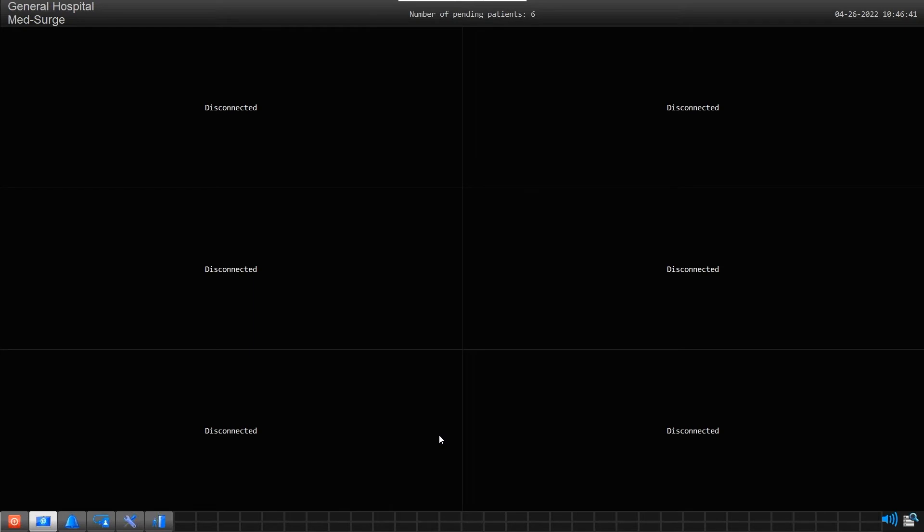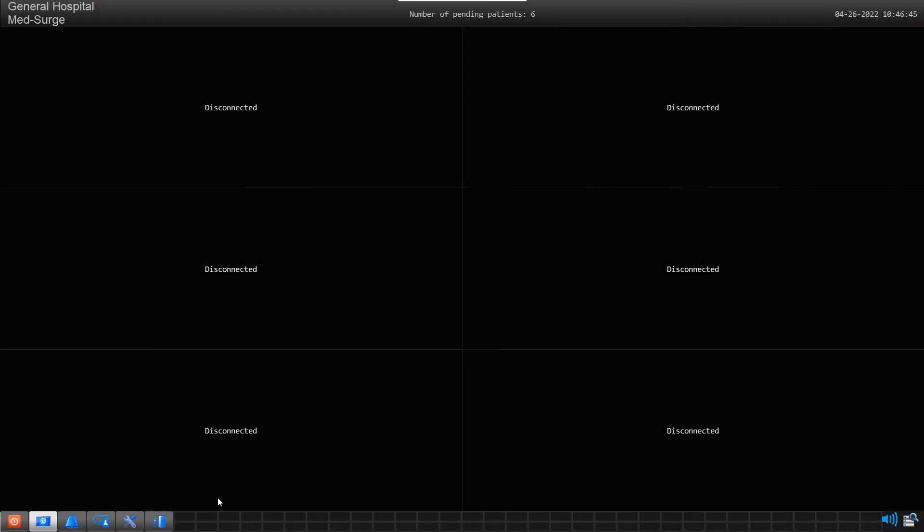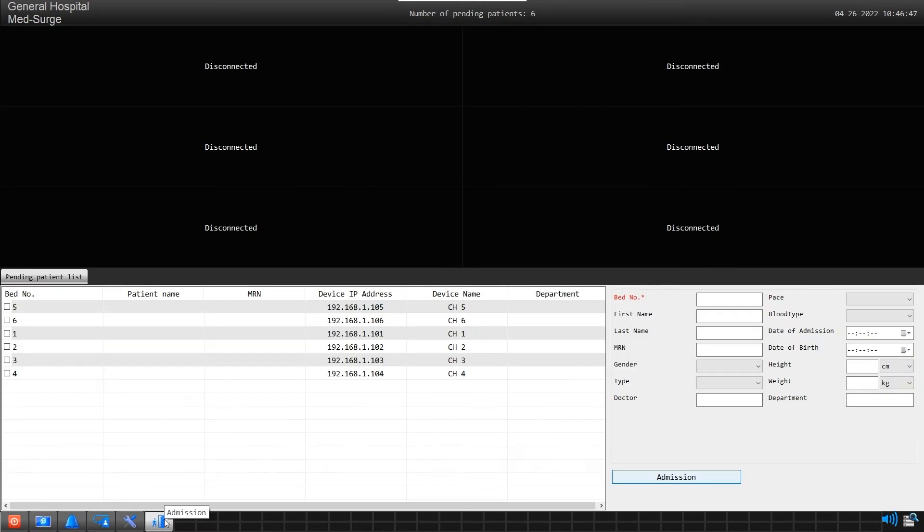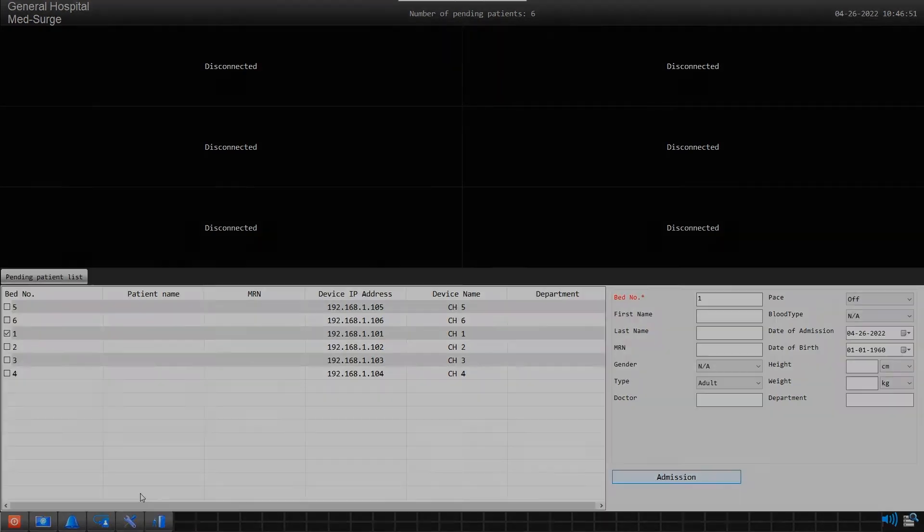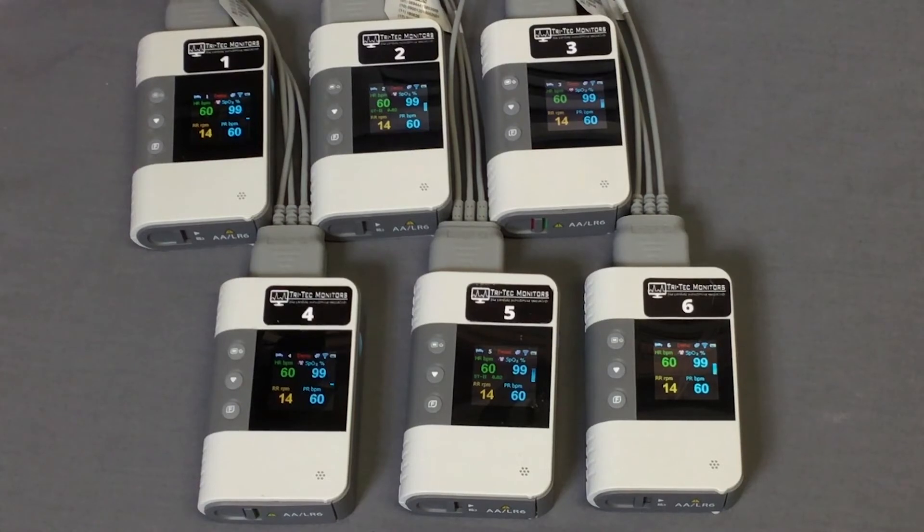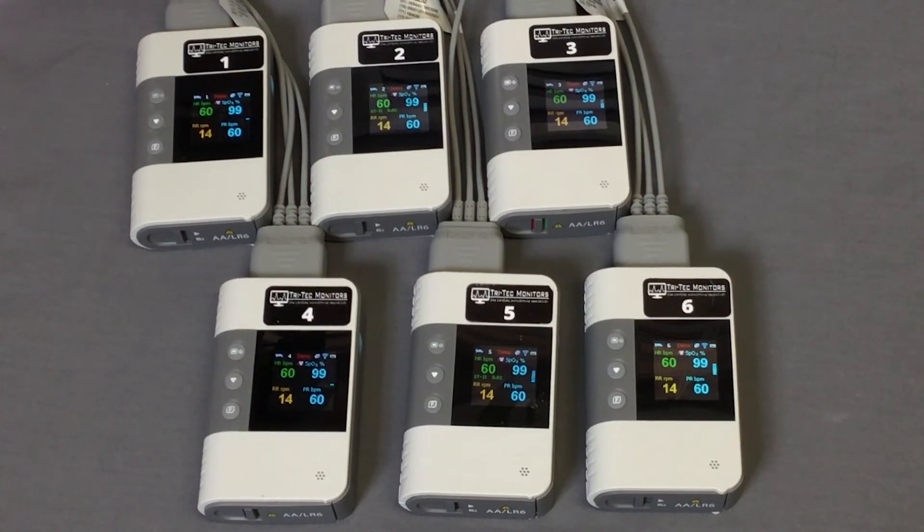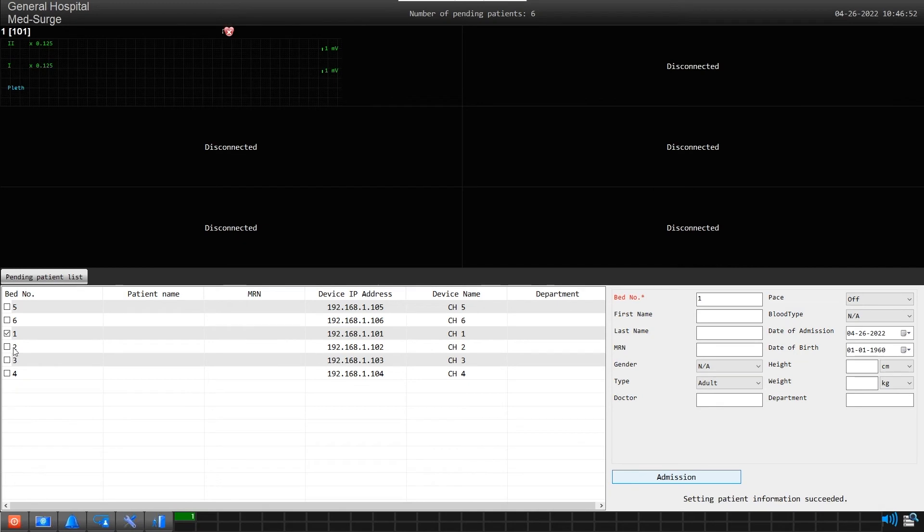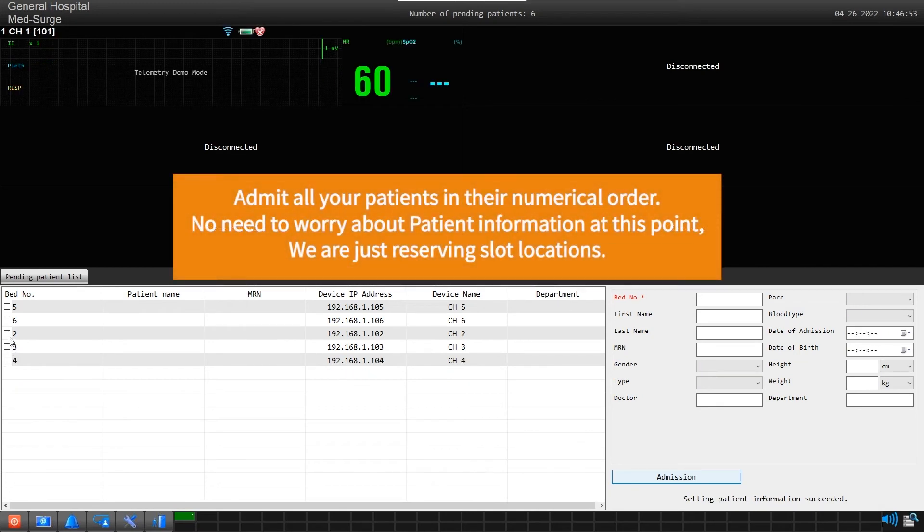Step 2: Next we must admit all your devices in their proper numerical order on the screen. For example, I have turned on all 6 of my transmitter devices, and they are now ready for admission. Starting with channel 1, admit that device to the screen.